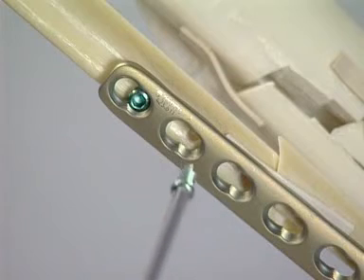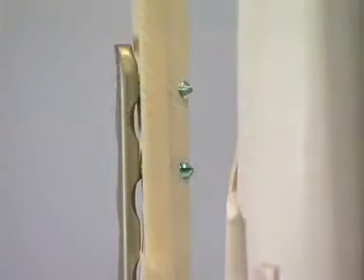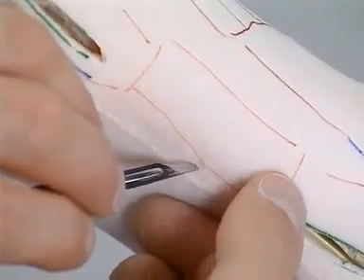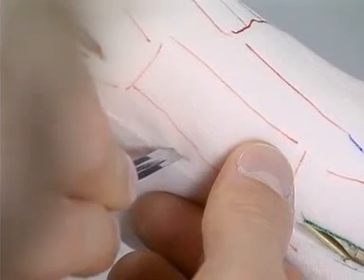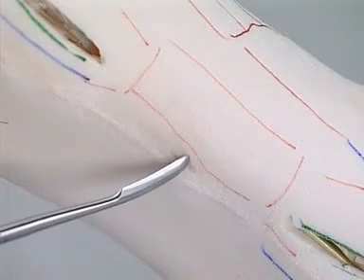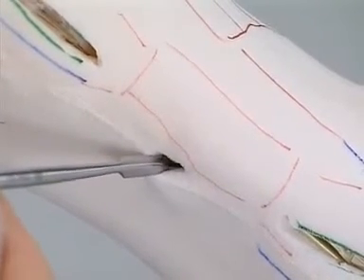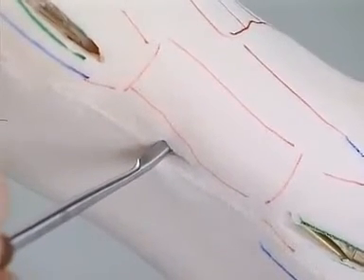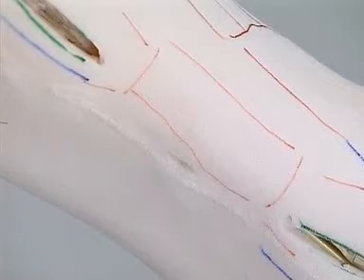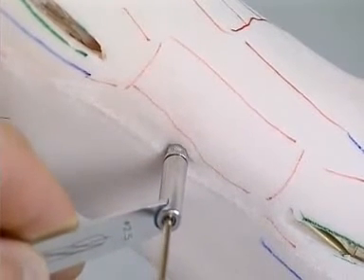To complete the internal bridging fixation, after pre-drilling, a second self-tapping locking head screw is inserted into the proximal section. Should the intermediate segment still be clearly dislocated, it can be drawn onto the plate with a cortex screw inserted percutaneously. For this, the hole is drilled with the 2.5 mm drill bit through the 3.5 universal drill guide.